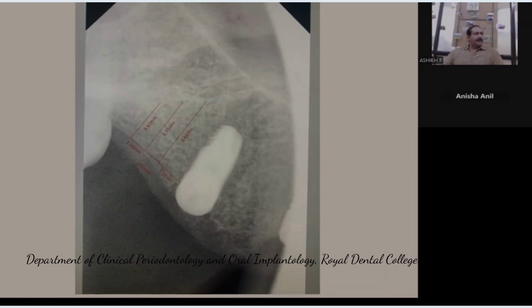Now what about the height? It's only 6 millimeters. That further 2 millimeter floor has to be broken. So you now have a diameter of 3.6, not 2. If you had tried a sinus lift at 2, you would be using smaller diameter osteotomes, which will definitely break and penetrate the sinus floor and the Schneiderian membrane. But right now, you have expanded it to 3.6.